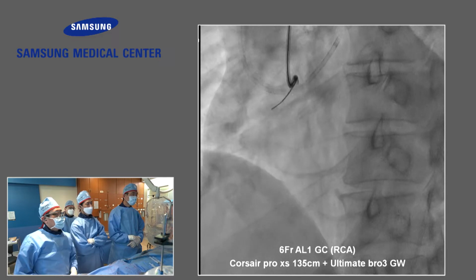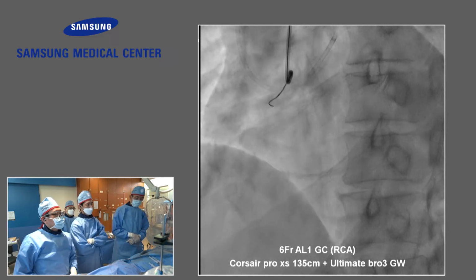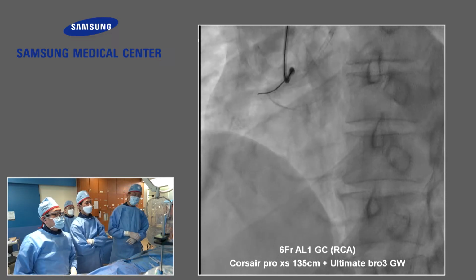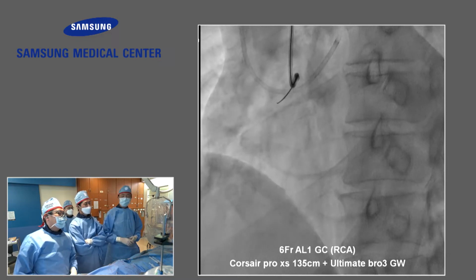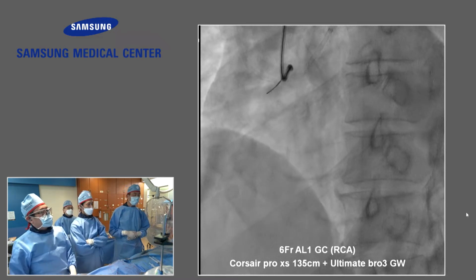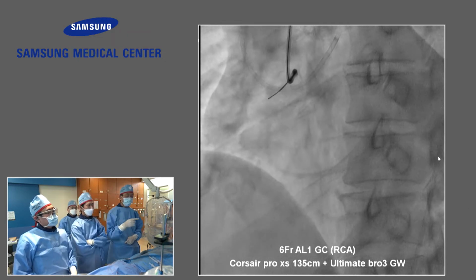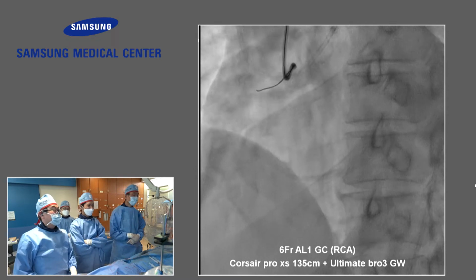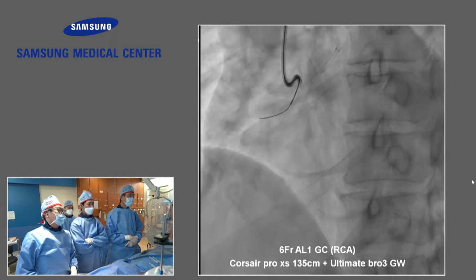I agree that for the integrated approach, you need an anchor balloon to stabilize the backup. I'd like to apologize that there is a progress of the procedure. So this is like a video demonstration. My plan was to try antegrade for 5 or 10 minutes, and the video is on. We discuss and try the retrograde approach. That was my plan. But next, it looks like a video demo. Okay. Fortunately, the UB3 wire catches the proximal segment.